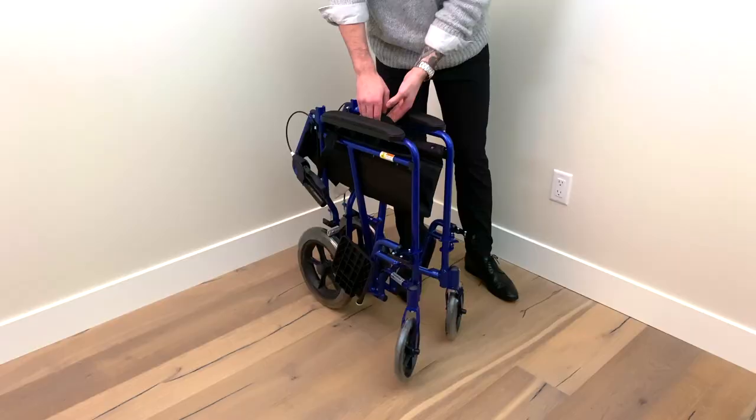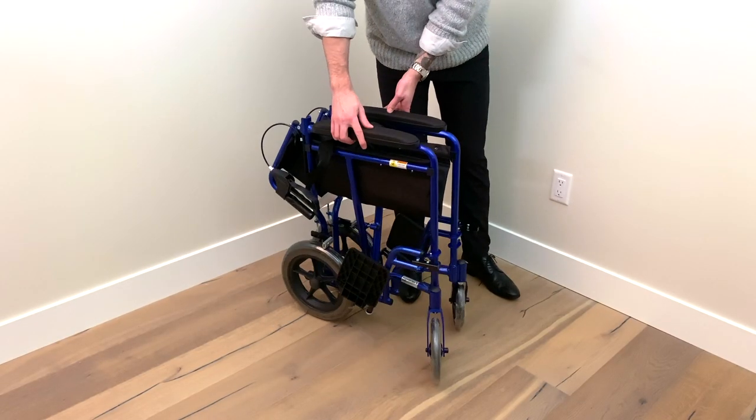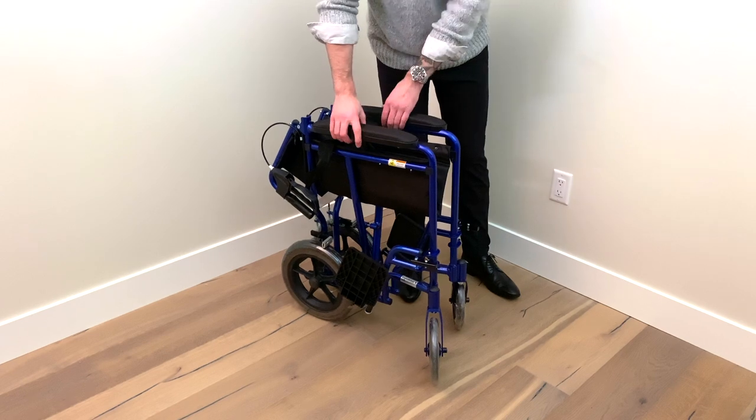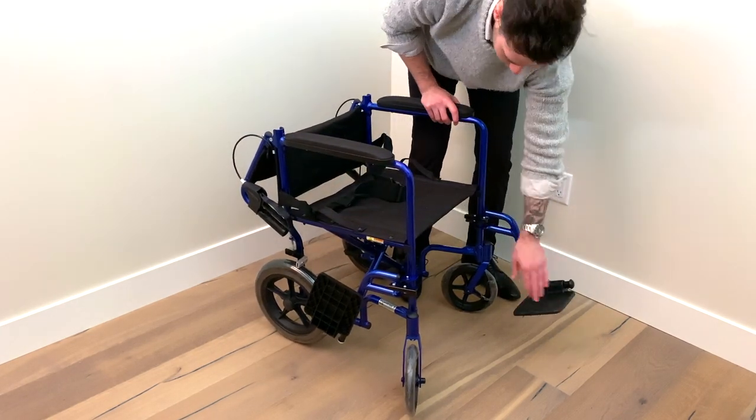And just like that, your transport chair can be easily tucked away. Check out HaloHealthcare.com for this and many more mobility aids.